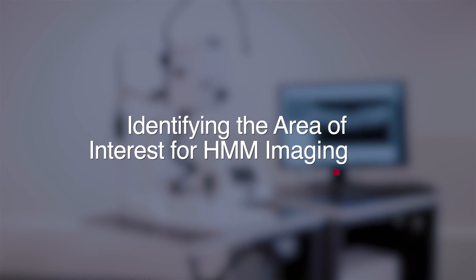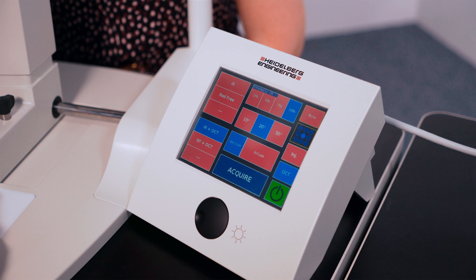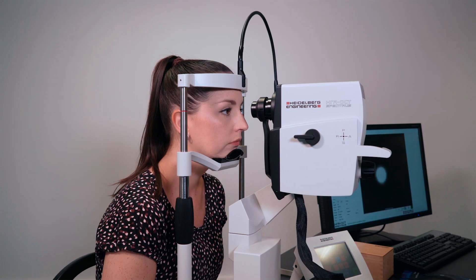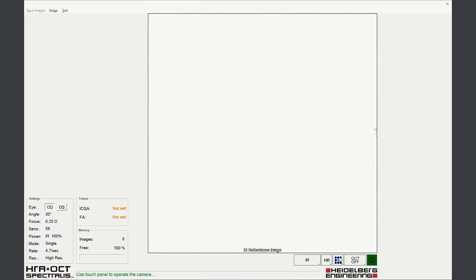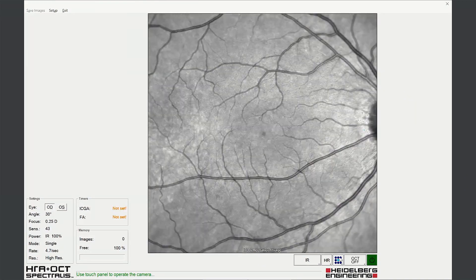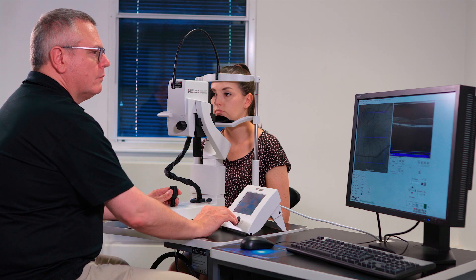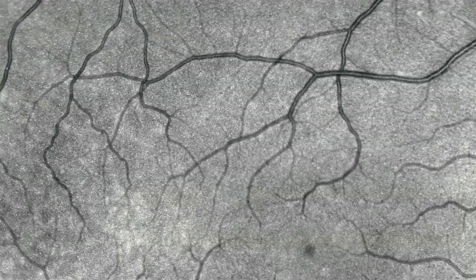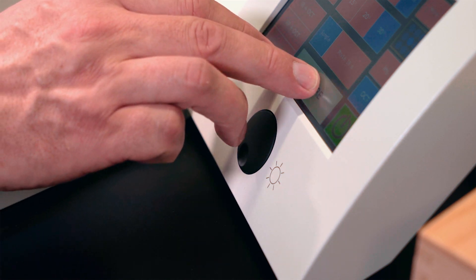Identifying regions of interest. Regions of interest can be identified by acquiring a 30 degree image of the eye. Align the camera head in the normal way, ensuring even fundus illumination, adjusting for brightness and optimum focus. Look for a starry sky appearance within the fundus image — this corresponds to reflection from photoreceptor structure. Acquire an image for reference.